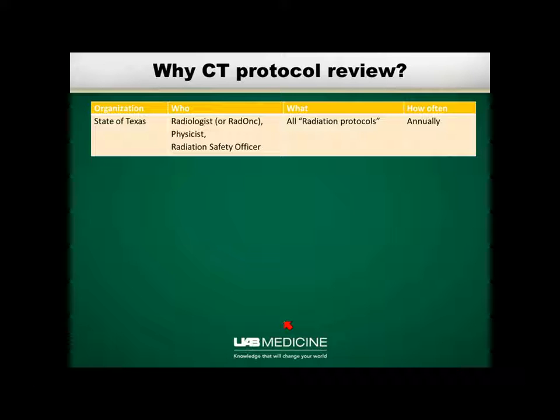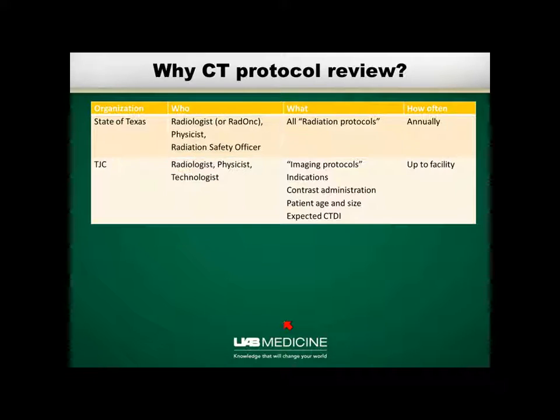But I've also been told by people practicing in the state of Texas that the state inspectors want to see more than that too. They want to see more like a real CT protocol review going on. Joint Commission, of course, is the 800-pound gorilla of this field. That may not quite carry the force of law, but I can assure you if your hospital loses accreditation because your CT protocol was the final straw that broke the camel's back, it's not going to make any difference whether or not this carries legal weight.